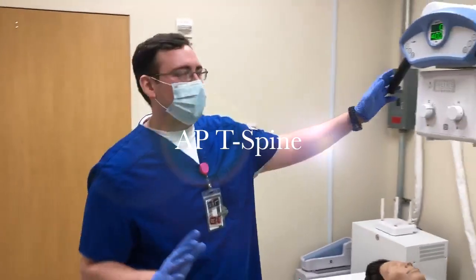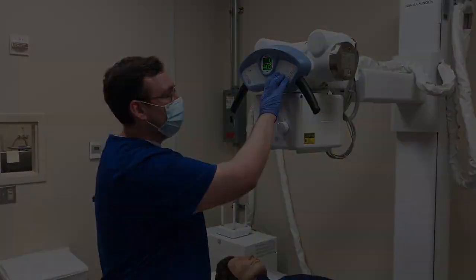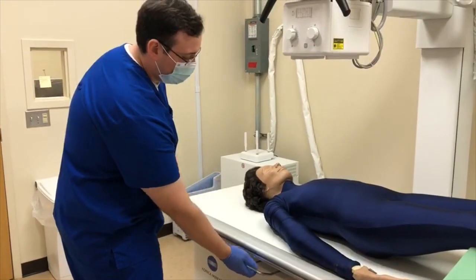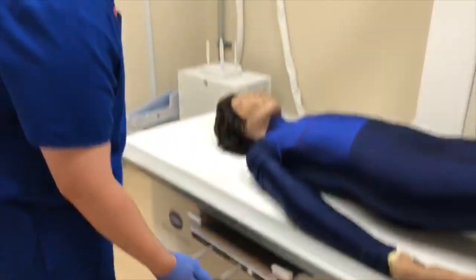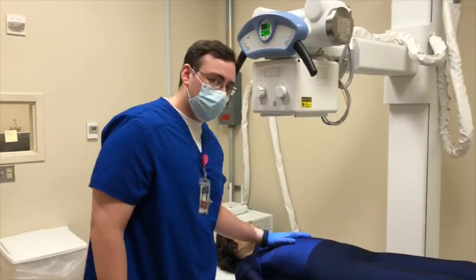So first you're going to get the room ready, and it's going to consist of having a 40-inch SID, and then you're going to check to see it's going to be a 14 by 17 IR, and it's going to be in portrait mode. You're going to check to see if it's aligned, which it is. And after this point, you'd go get your patient, but for now we only have Molly, so you'd position them.